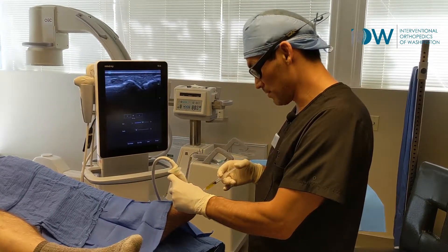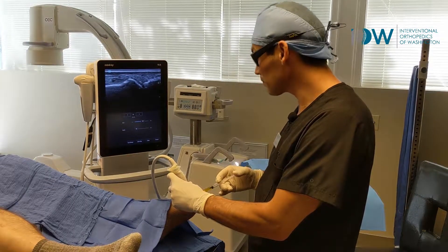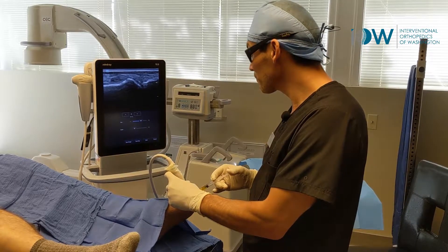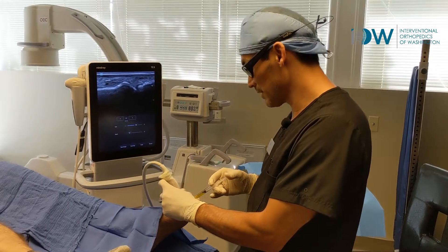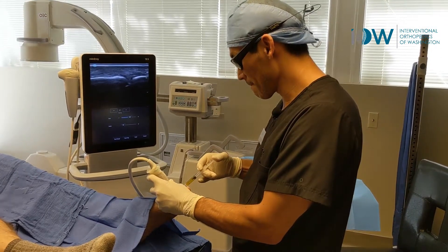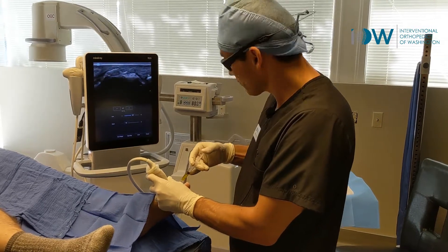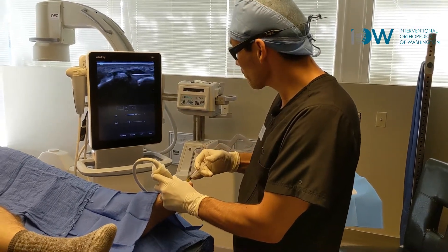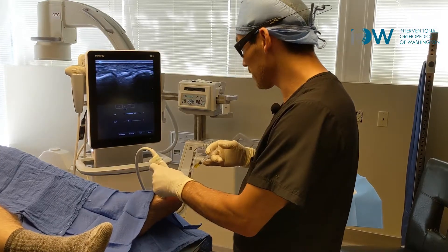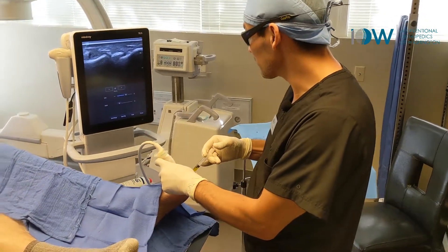Alright, the poke here coming in. Let me know if it's too uncomfortable. See that needle coming in, we're treating that capsule, adding a couple of different areas here. That capsule wraps all the way around the toe and it really supports the toe, so it needs to be addressed.